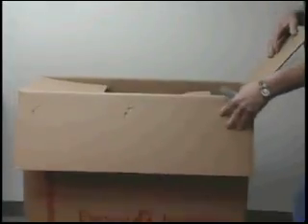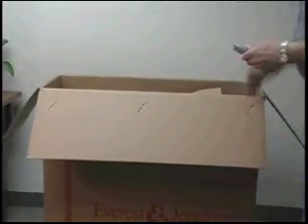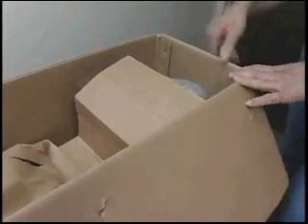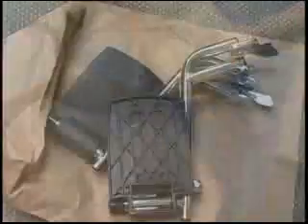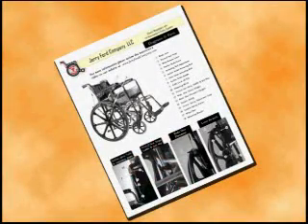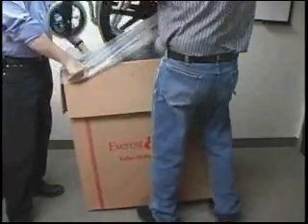If all is well, please carefully open the shipping box without damaging the box itself, so that if a return of the product is necessary for any reason, the product can be repackaged in the same box and picked up by our shipper. Each box containing a wheelchair or wheelchair-mounted safety system should include a package with the wheelchair's footrests, a manufacturer's instruction manual for the wheelchair, instructions from the Jerry Ford Company, additional packaging materials, and the pre-assembled wheelchair product. Care should be taken when removing the wheelchair from the box.